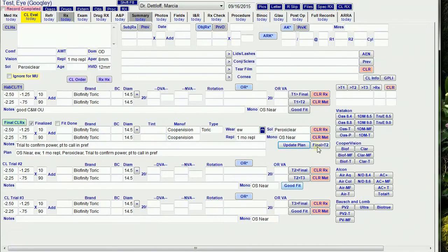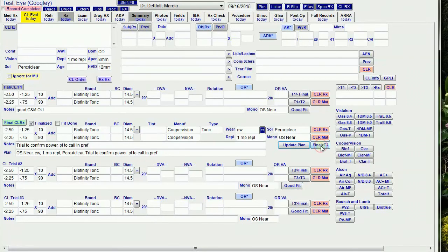The Final to T2 button comes in handy when I try a new lens on a patient and they call back and say they prefer the original. I go and edit the record and copy the Final to T2.